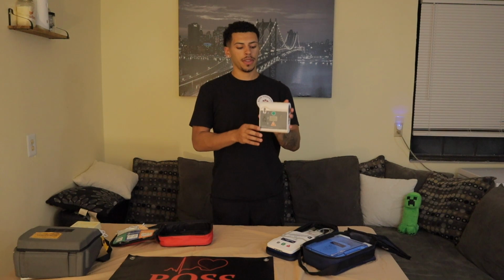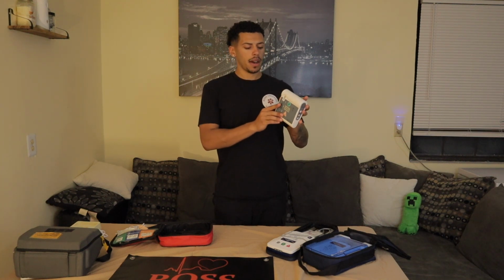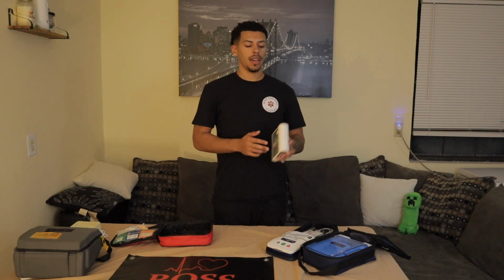I typically use this when I'm teaching a larger group of students. This thing is less finicky when it comes to the pad placement. These other two AEDs want you to place the pads on perfectly every single time or it will not move on. But when I'm teaching a larger, younger group of students, I believe it's more beneficial for them just to get the practice of getting the pads on.